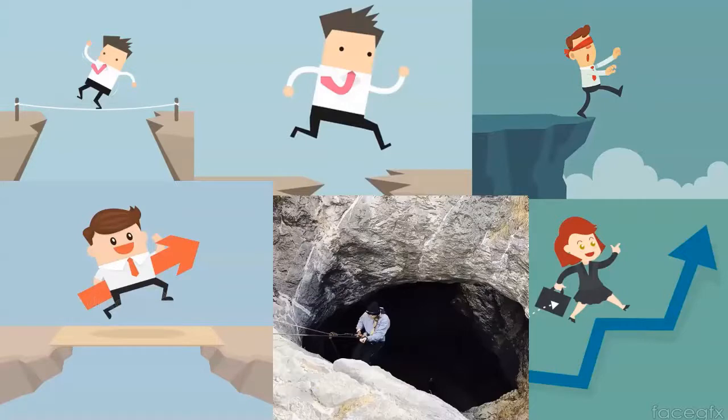Okay, let us move past these pitfalls and obstacles, mammographic obstacles.